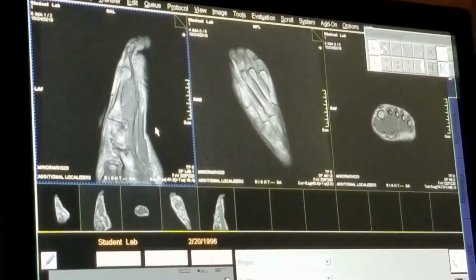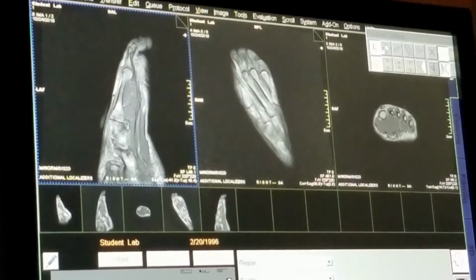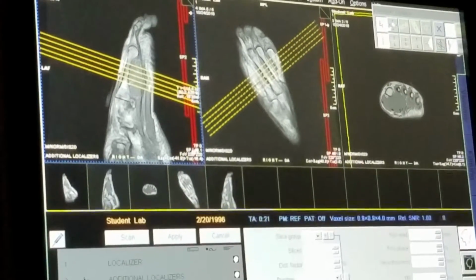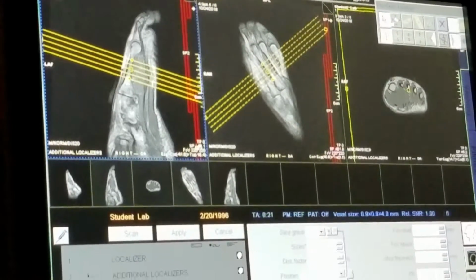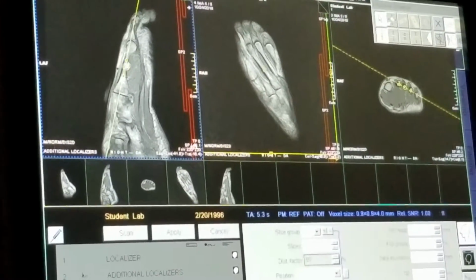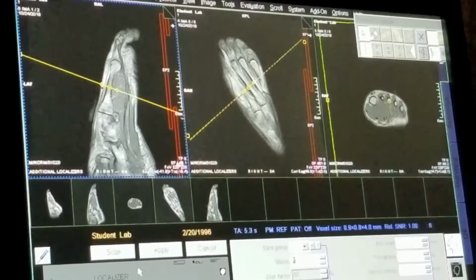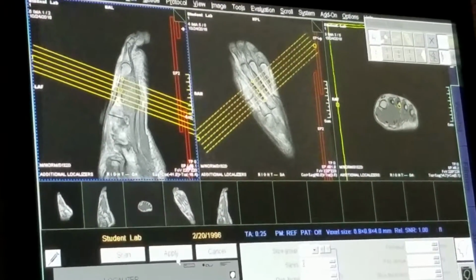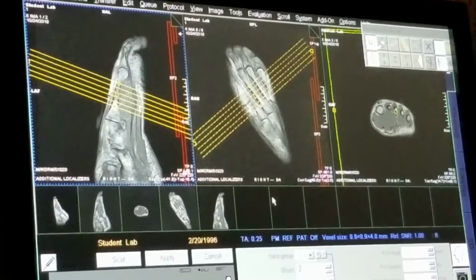Oh, nice. Okay? So now, we'll bring our short axis view down that we did earlier, and we're going to be perpendicular to this. And you can either eyeball it the way we're doing it, or similar to the technique that I showed you in the shoulder, if you go parallel with the long axis and then protocol turn group, that'll put you perpendicular also. Okay? And now you can see that we're not only perpendicular perfectly off the sagittal, but off of the long axis as well.